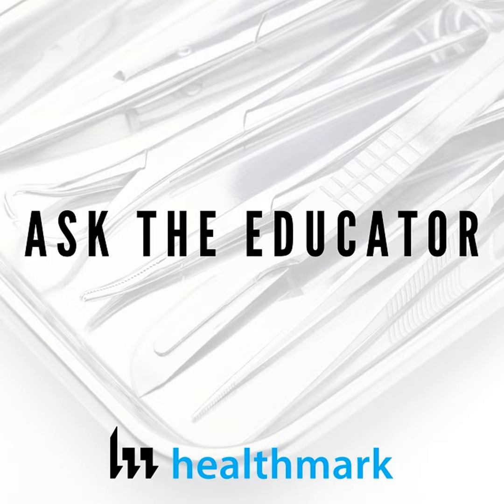I've actually been trying to collect some data on this because I think it's a really important topic. I'm glad that you mentioned, sort of glad. In a lot of ways, I'm not glad, but just the fact that you guys had an outbreak, it's one of those things that I think people kind of forget that these devices do carry risk with them. I know that there were the documented cases in Texas back in 2009, which is what AORN cites as their rationale for recommending borescope inspection, which is great.